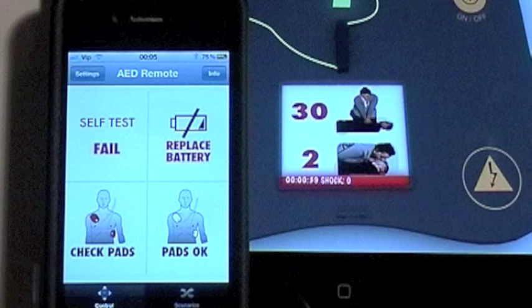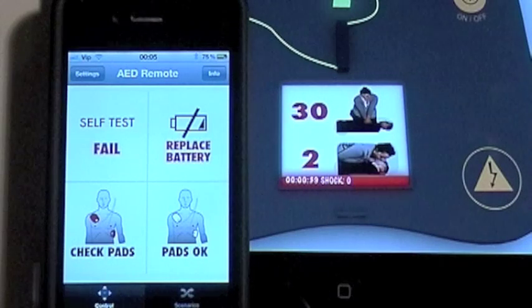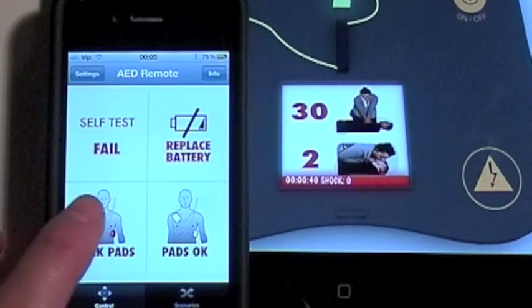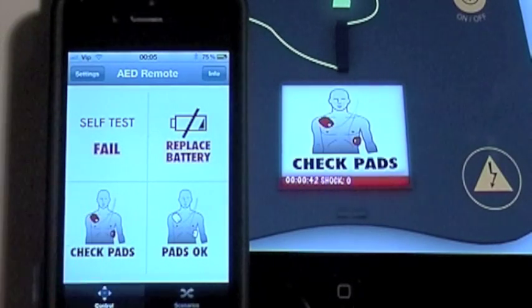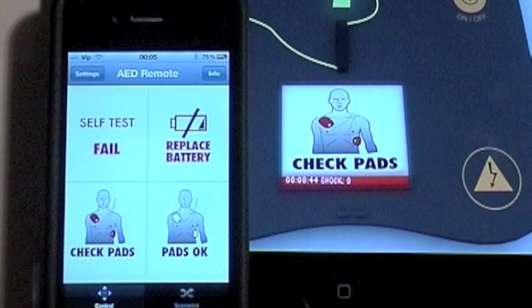In order to simulate the poor Pads connection and force the student to correct the Pads position, you can tap on the Check Pads button. Rhythm Analysis will continue once you tap on the Pads OK button.